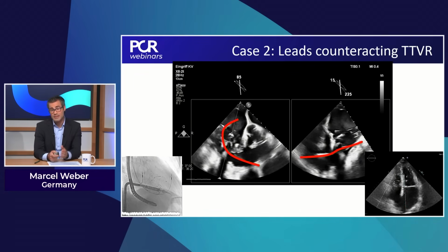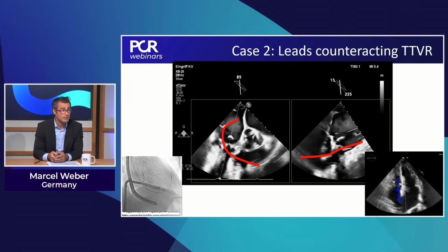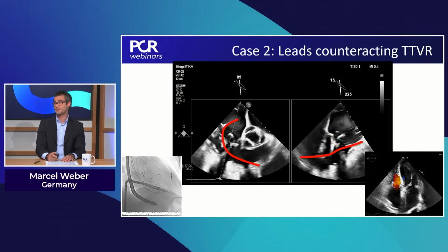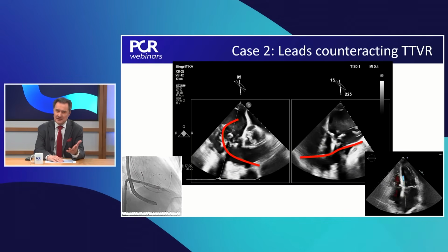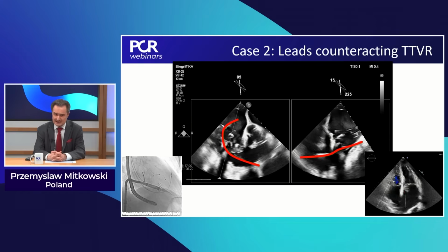But somehow the operation was quite good as well, and the patient as well. But of course, it was not our plan. I am strongly against placing anything in the superior vena cava, like a stent, because we have 3 leads here. The likelihood of any complication in the future is quite high.